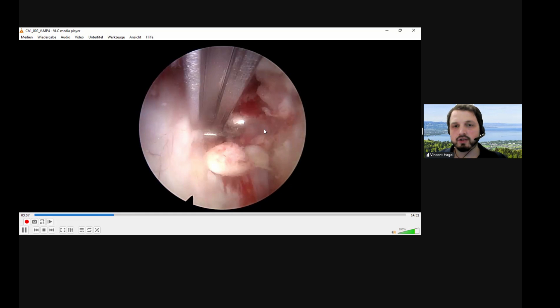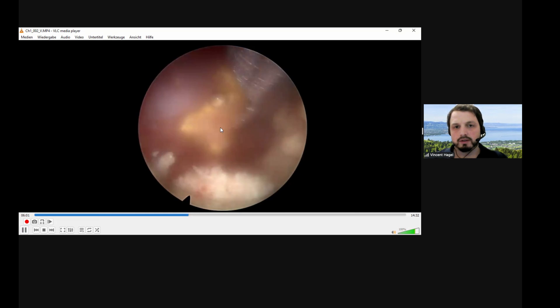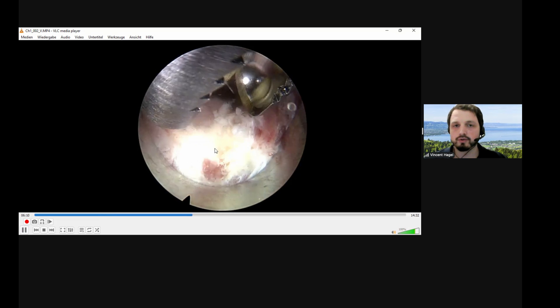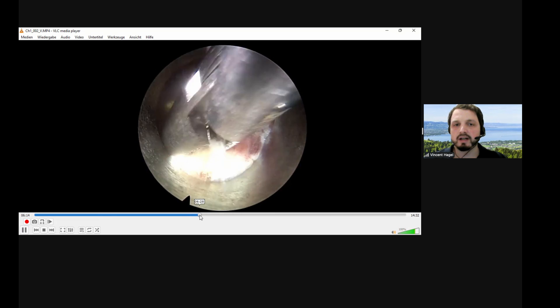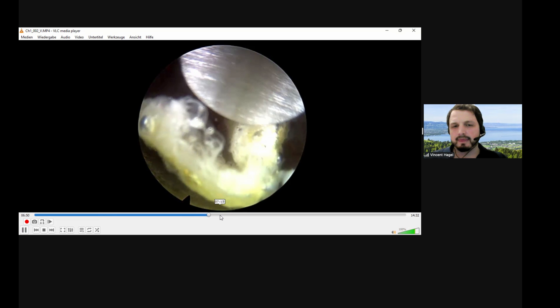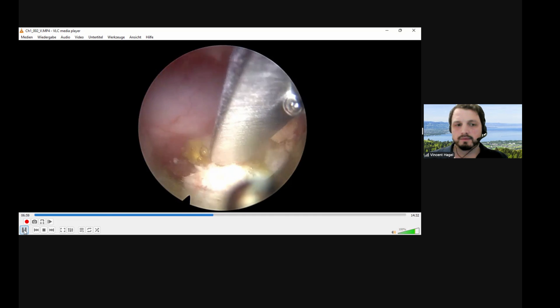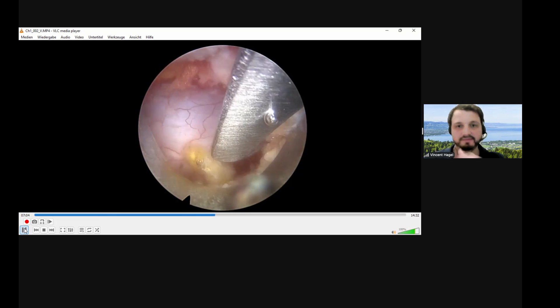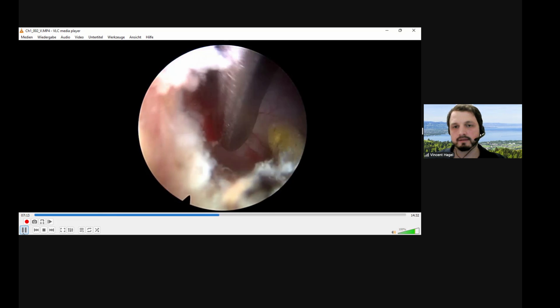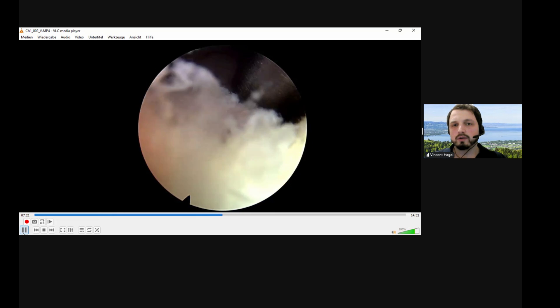After finishing the decompression right around the defect, I used some tacho seal to put over it. For me, it was too small to do a suture or even think about converting to microsurgery to suture it. Therefore, as a compromise, I tried to place this tacho seal on it. For U.S. viewers, tacho seal is a bovine collagen sponge. And just reminding viewers of scale — as you get close to it and look at it, it looks like a very big defect, but the footplate of your kerrison is only a couple of millimeters — really maybe three to four millimeters at most.